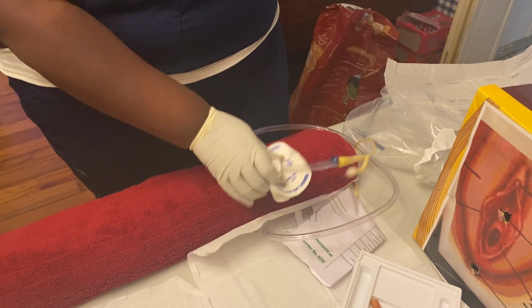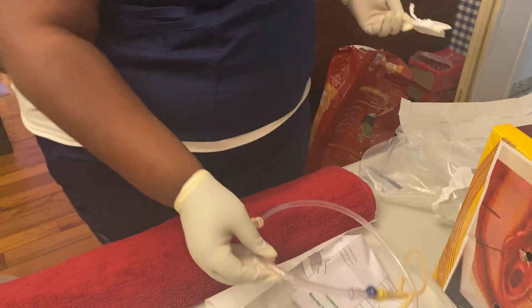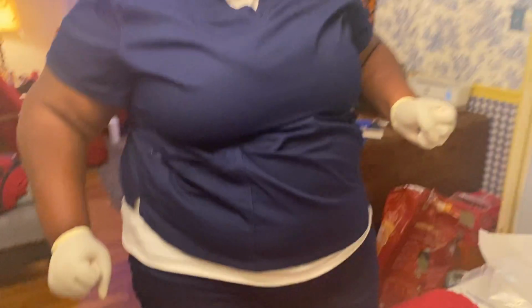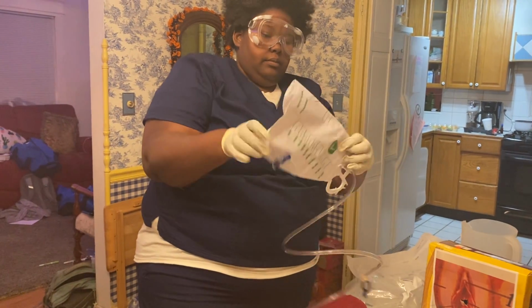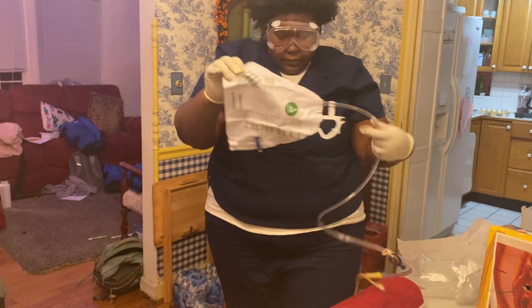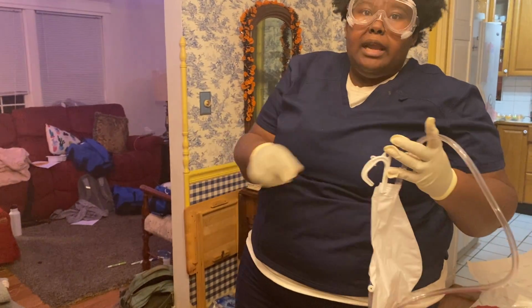Once I place it on the thigh, I'm going to undo it, and then remove this. Next, I'm going to put this on the bed frame, not the bed rail.